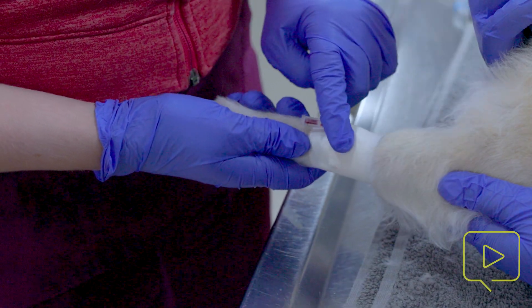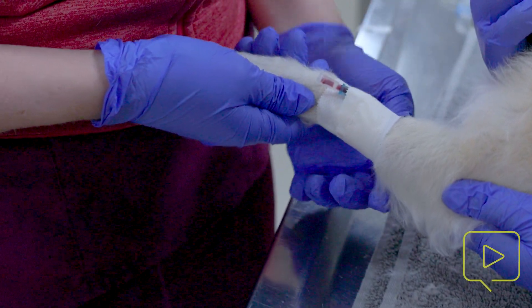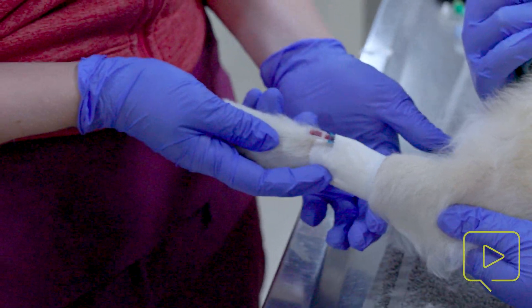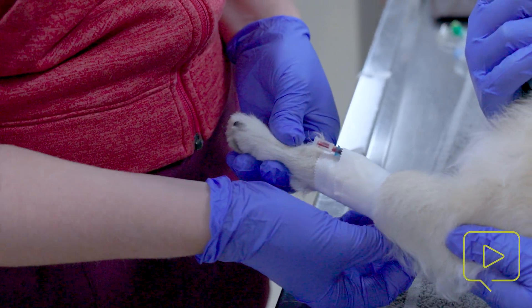We had shaved this patient all the way around. You don't necessarily have to, but if you do, you want to give good margins — shave at least the top half and leave the bottom. If they have feathers on the bottom, I would shave the feathers.